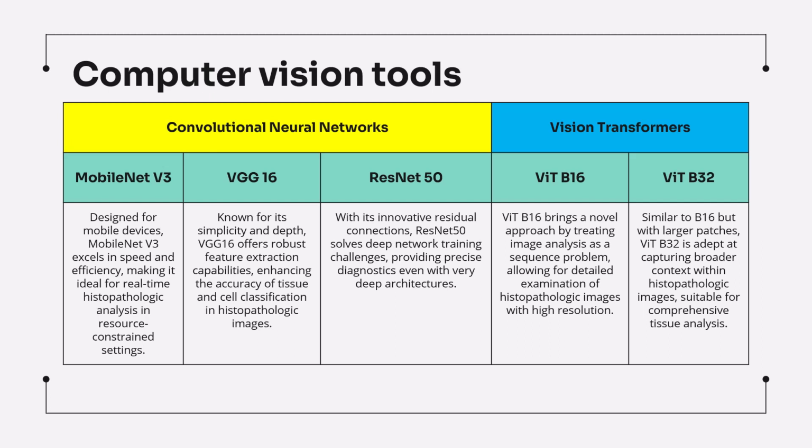VGG16 is very simple to use and offers robust feature extraction capabilities. ResNet 50 solves deep network training challenges, providing precise diagnostics even with very deep architecture.